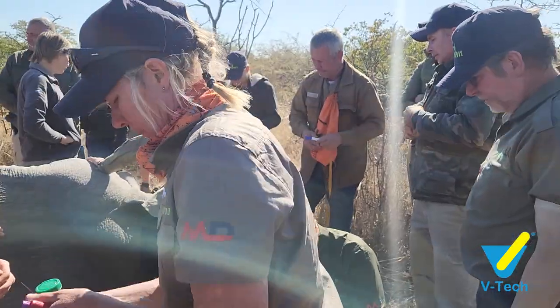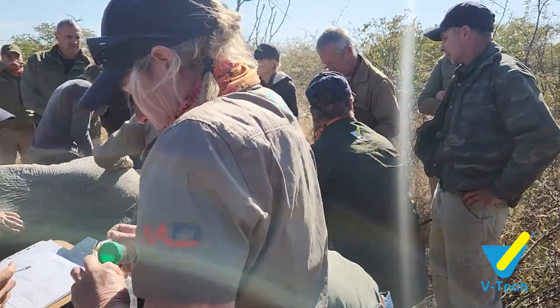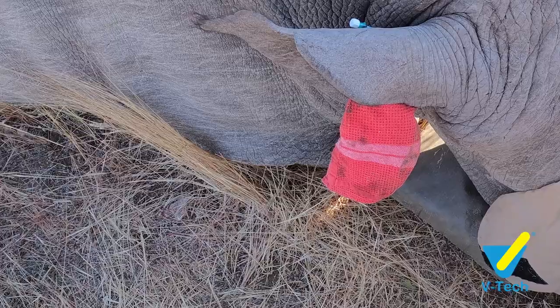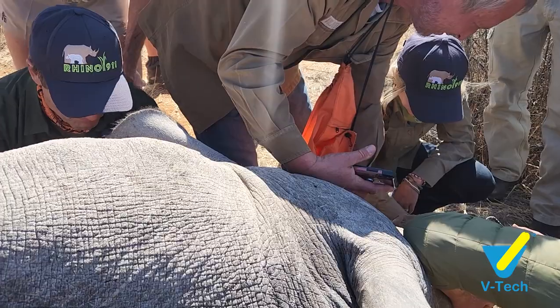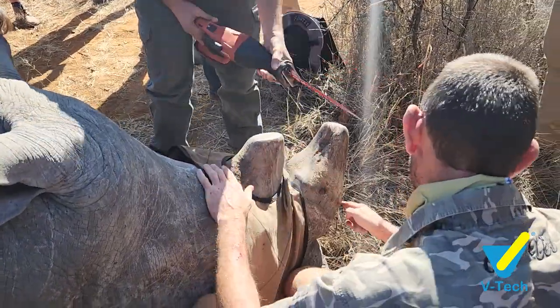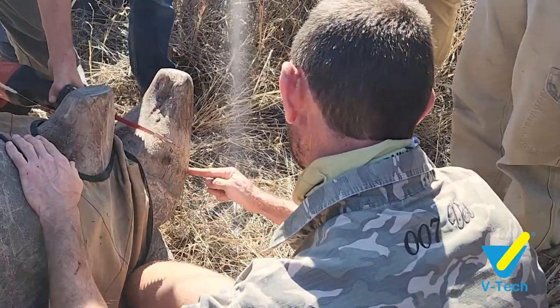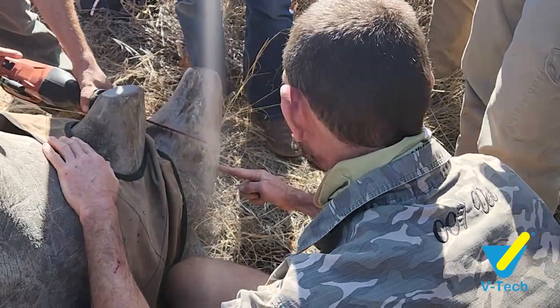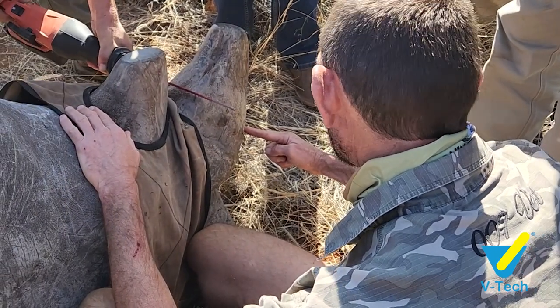I'd like to explain the different sites where you can take a blood sample from an immobilized rhino. The most well-known site is the ear veins at the back of the ear, which is quite easily accessible. However, sometimes you need a different spot — when there's a lot of commotion around the head, injury to the ear, or you only have one good ear vein that you'd rather save for a drip.